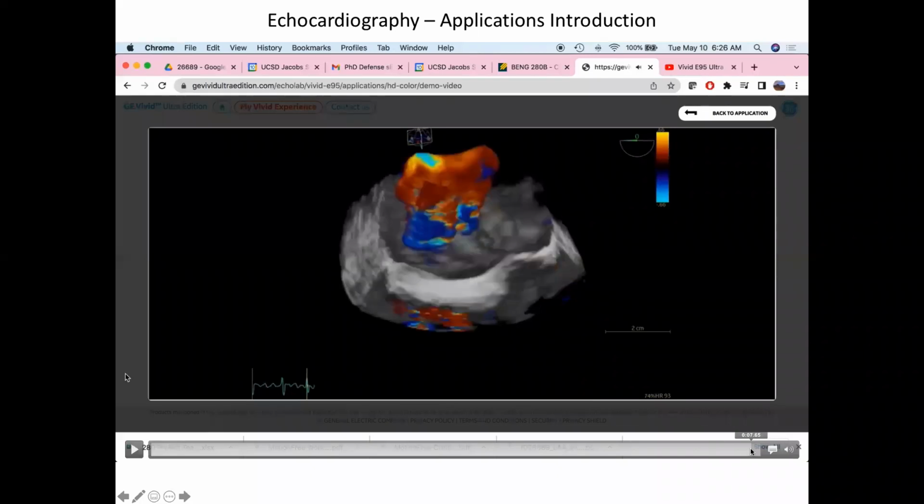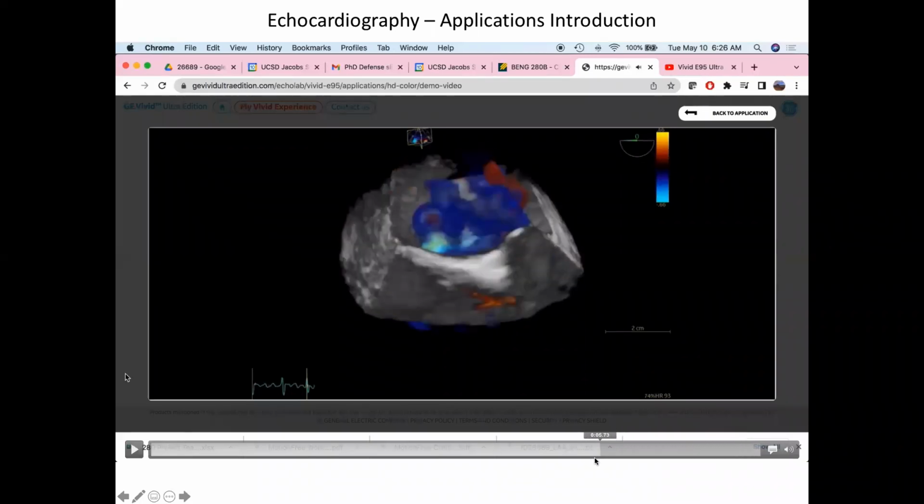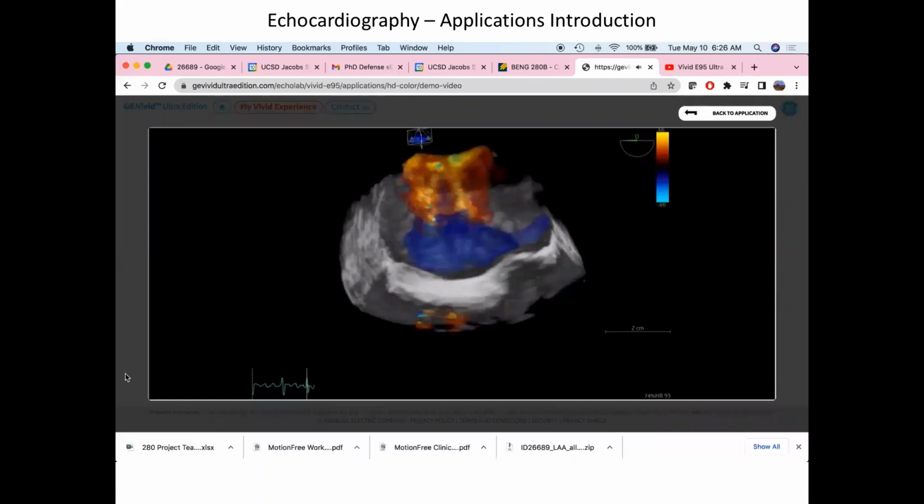And you can see, the issue with pure 3D ultrasound in some respects is that if you can't go fast enough to get everything done in one heartbeat, which is usually the case, you have to count on the fact that the heartbeat, say for 3 or 4 beats, will be the same.